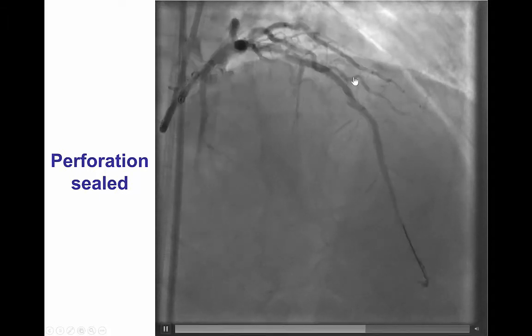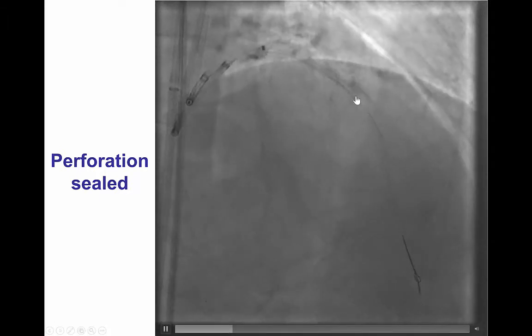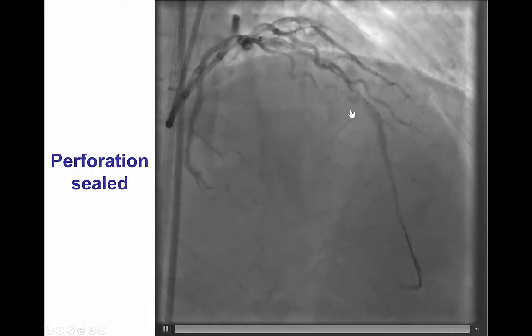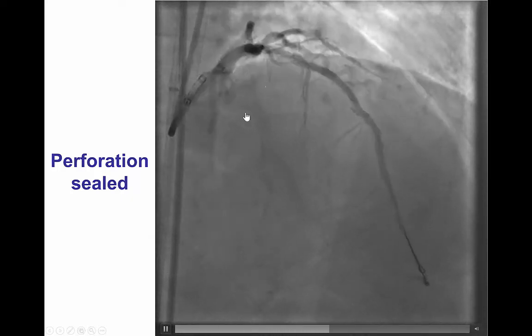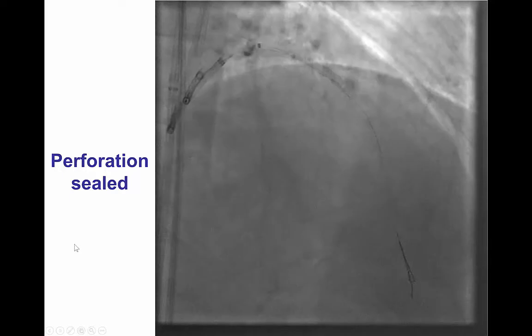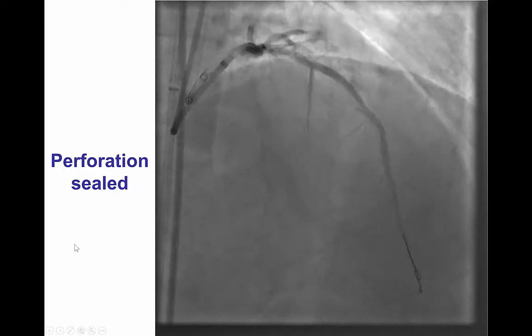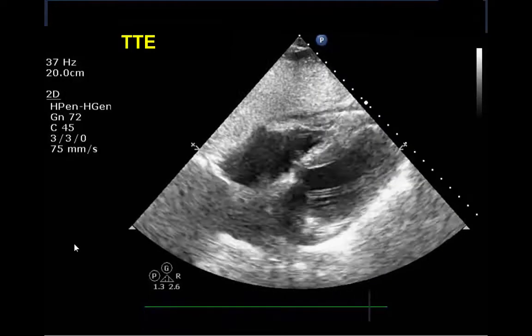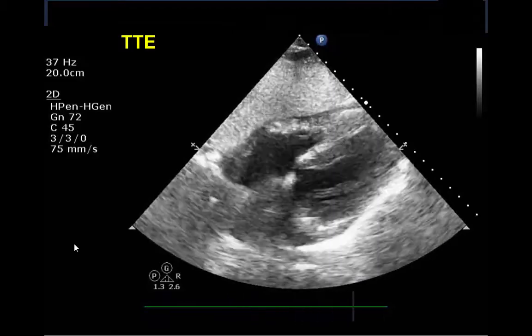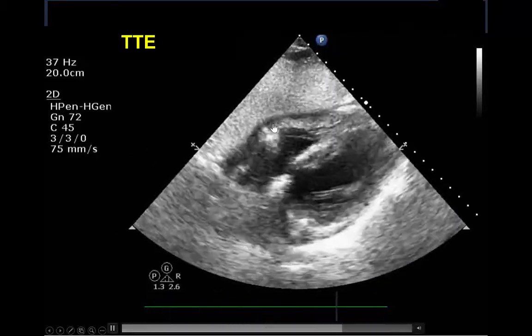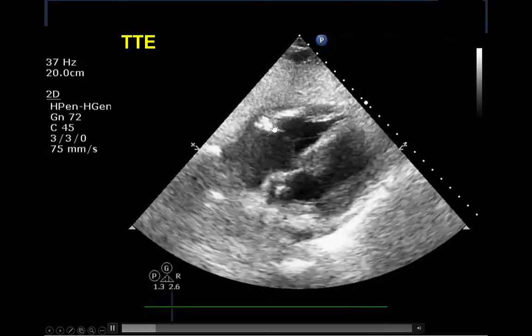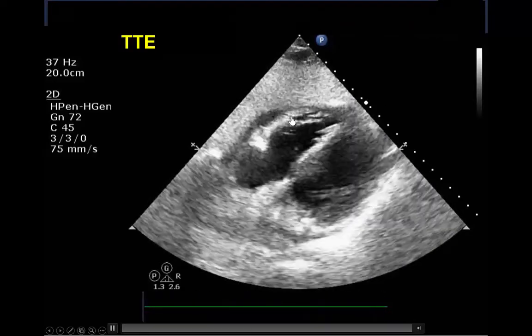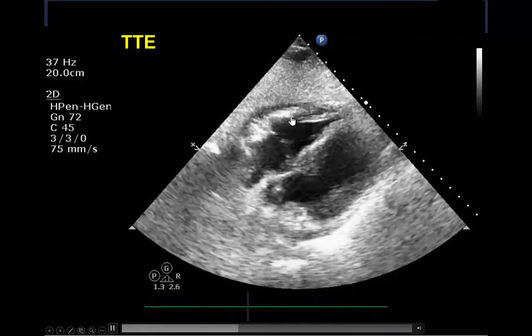In this particular case, after the covered stent was implanted, there was nice hemostasis achieved. There is some distal dissection and proximal irregularities, but the good news is the perforation is sealed. We did an echocardiogram that demonstrated only a small pericardial effusion, which is very encouraging. The patient did not have hypotension, therefore we did not need to perform pericardiocentesis.